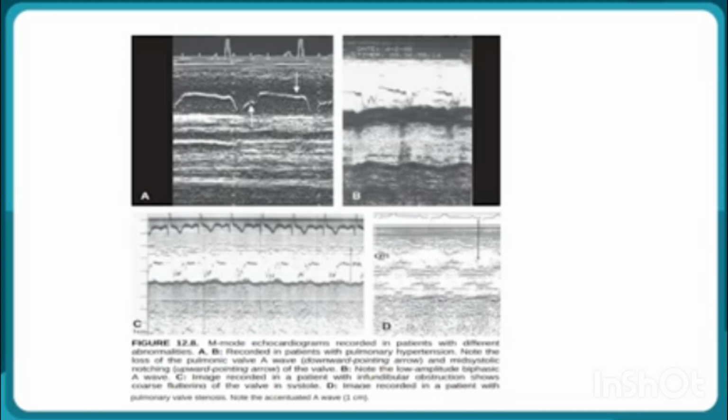These are the M mode images in real time, as shown in the following figures A, B, C, D, as I have explained in the previous slide.